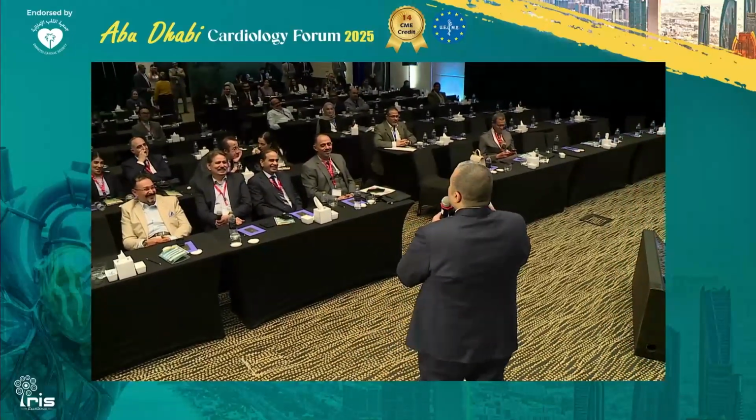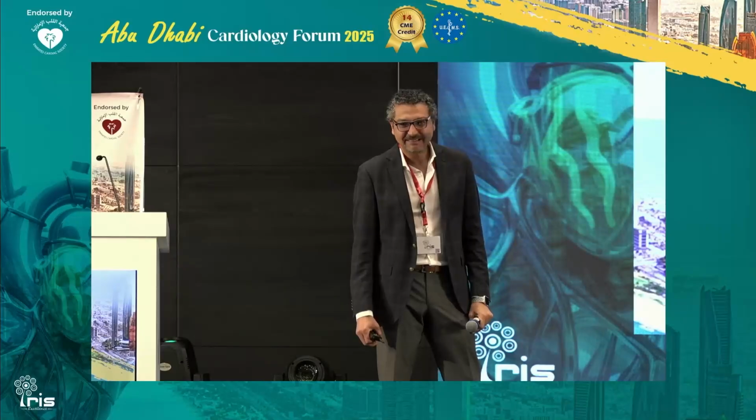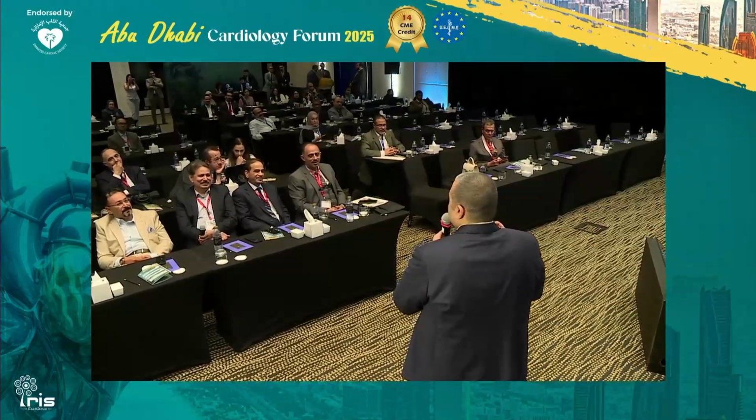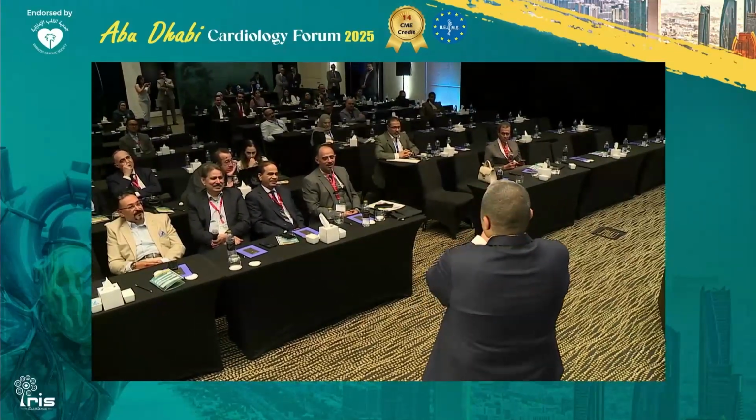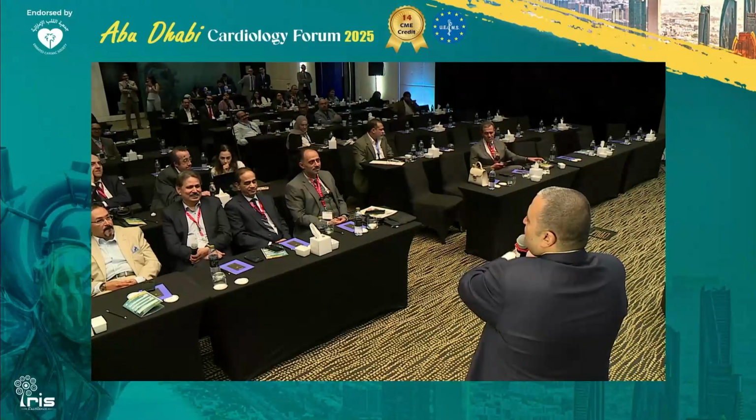So he did everything from scratch by himself. All these pictures, even this fist, how we put this here, how is the orientation, he did everything. And actually he's been doing it since the last year's conference. Then a few weeks back, he told me, Ahmed, I have something, but it will take time.